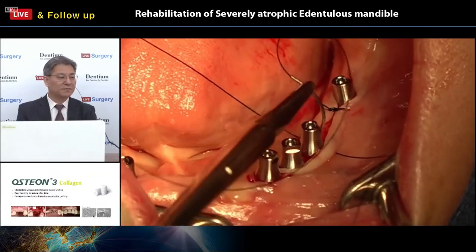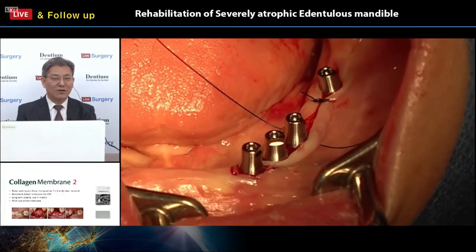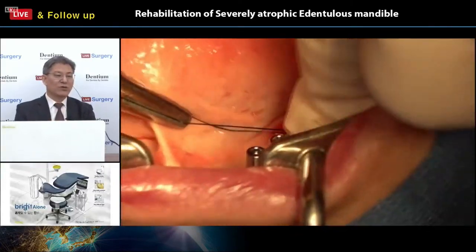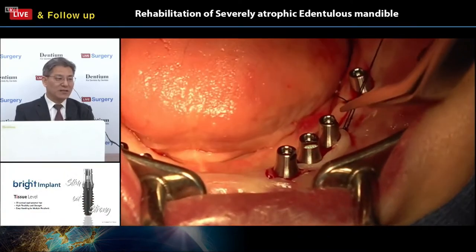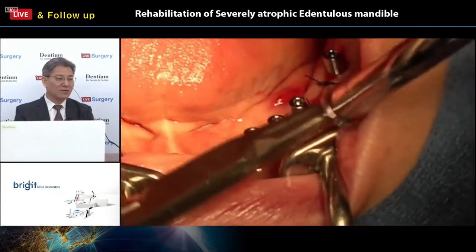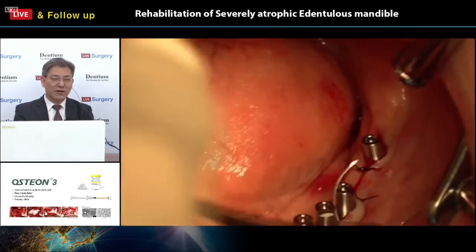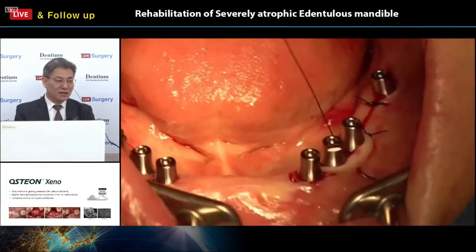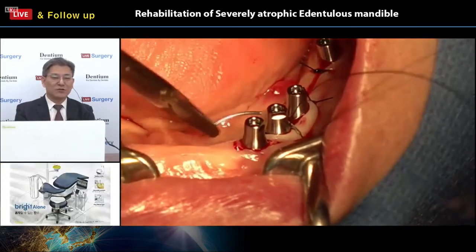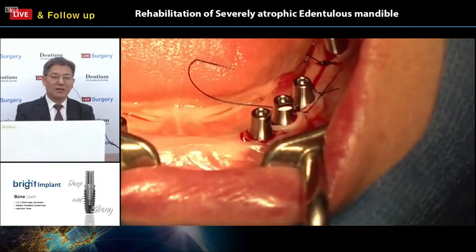That's the tapping type device. The score of the tapping, after tapping with these Trust devices, is very similar, or almost the same as the ISQ values of the Osstell Mantle devices. So I think nowadays I prefer to use this Trust easy checking system, because after connecting the healing abutment, these devices are also available for use, like in this scanning jig situation, all in the intraoral situation without screwing out. No screw out, just tapping, and that's it.